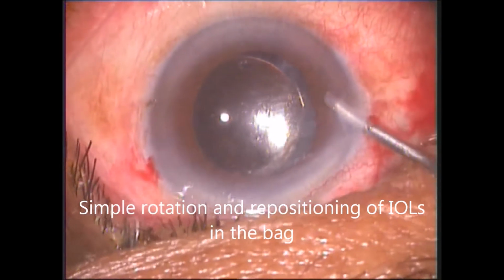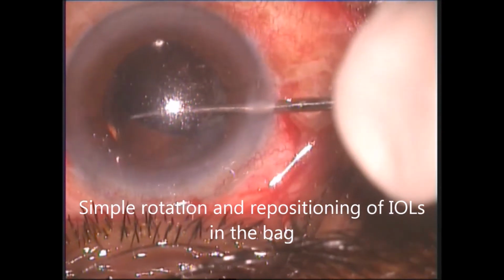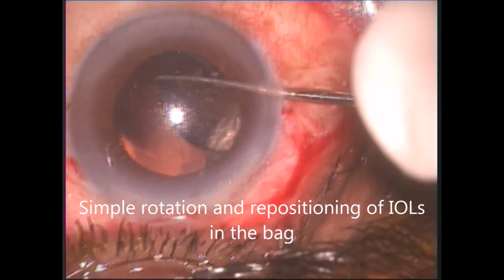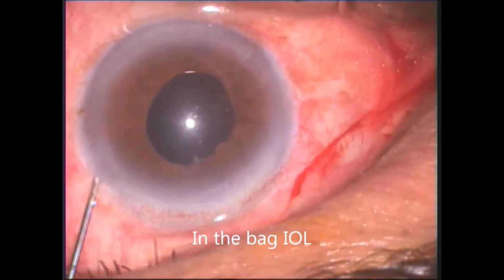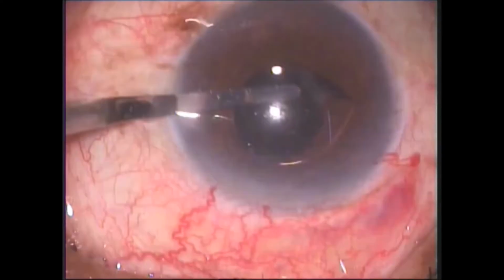As in this case, one haptic is in the bag, another one is in the sulcus, which can be rotated and repositioned back with the help of a Sinskey hook. IOL got its home. Sometimes we may see synechias. They bring out the IOL from its home.